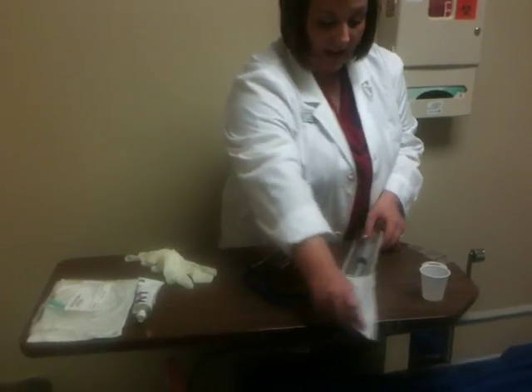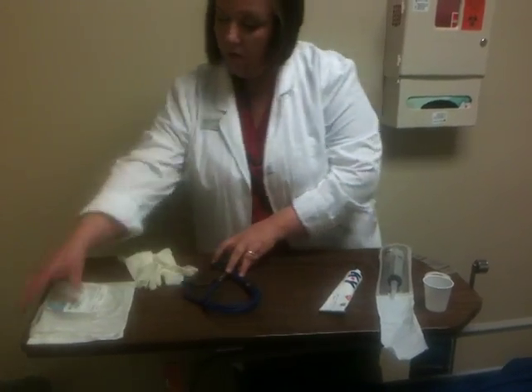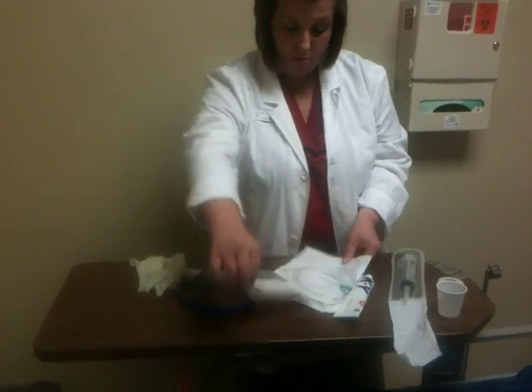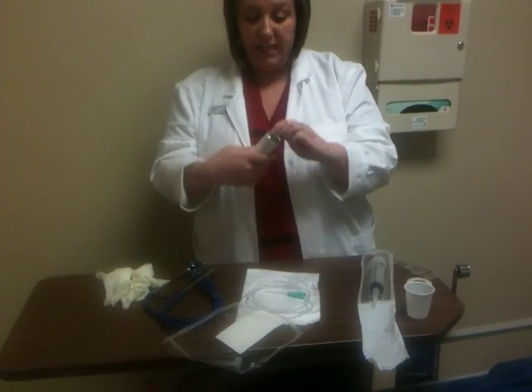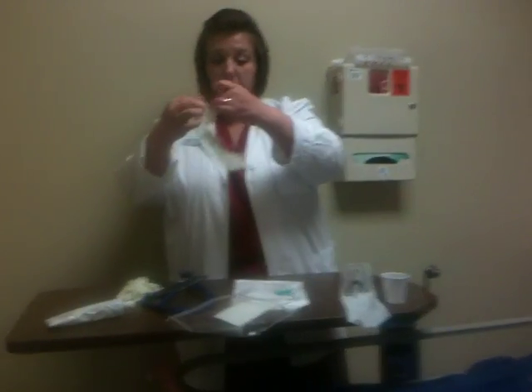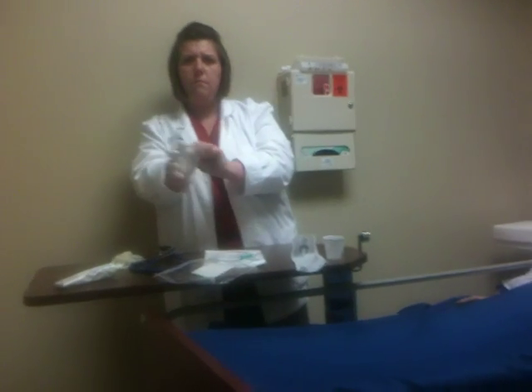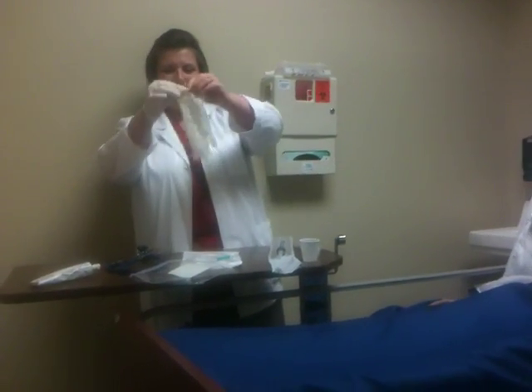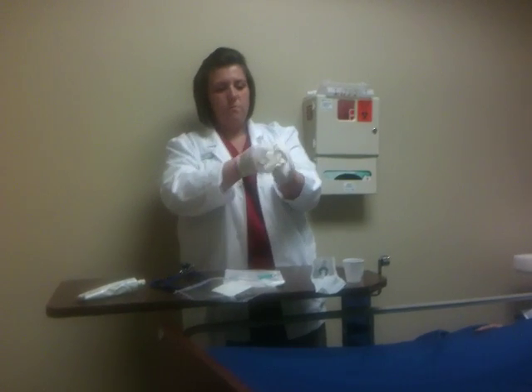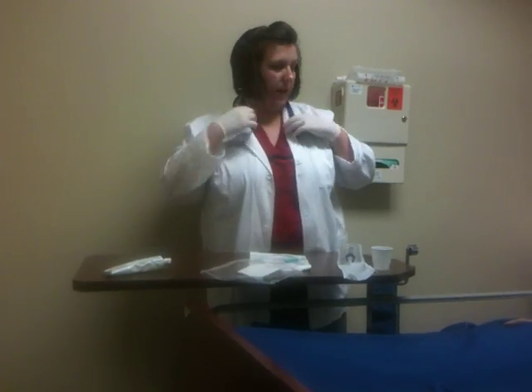Go ahead and open up my catheter tip syringe. I'm going to go ahead and open up my tube. At this point, if you had a packet of lubricant or if you had a tube like this, you would open your lubricant and you could squirt it into your paper and it would make it easier for you to be able to lubricate. Okay? I'm going to go ahead and put my gloves on. Right. I got my stethoscope.